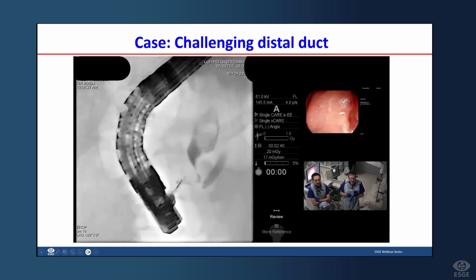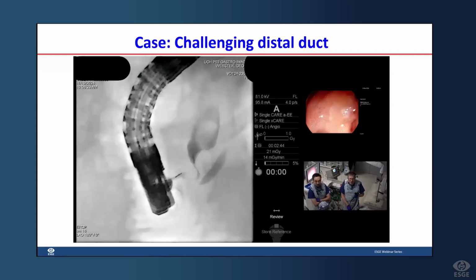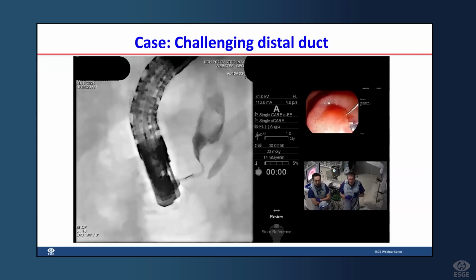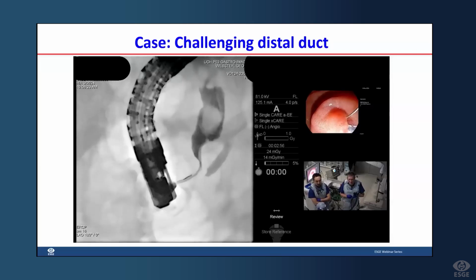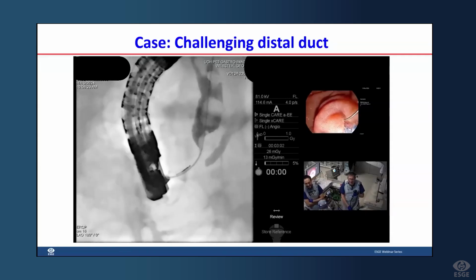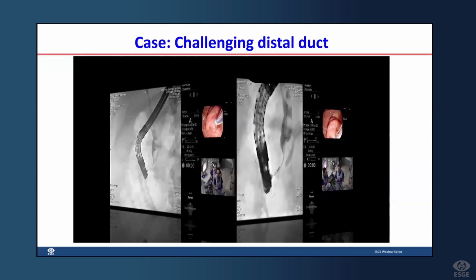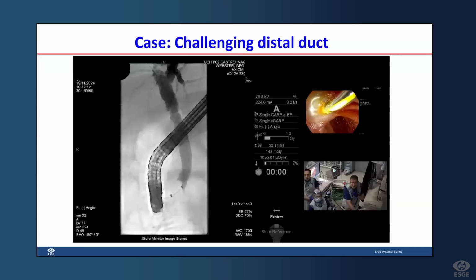Stop there. Now, what I'm going to try and do, screen please, is shorten the scope. There we are. There we are. I'm really short now. I'm going to go with the wire. And there we go. Round the corner. What a very interesting example. Yeah, really useful to have the contrast to guide us. Okay, back to you, Heng. Yep. That's it. Superb. So we're going to do a little cut now. Out with the sphincterotomy, and take that.